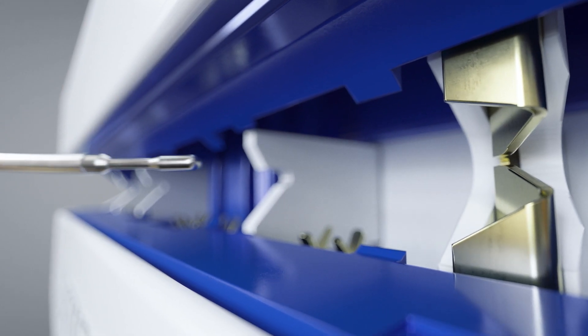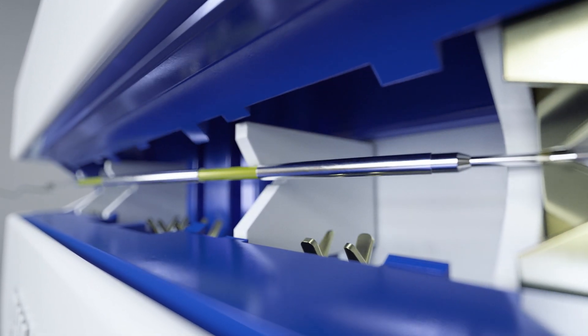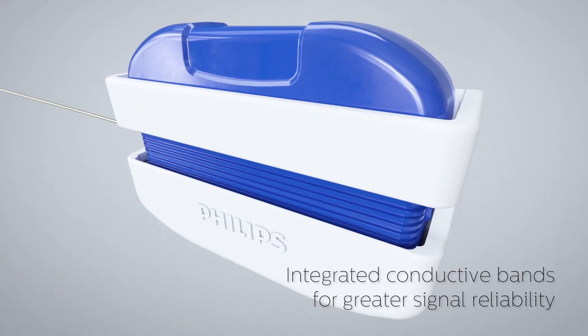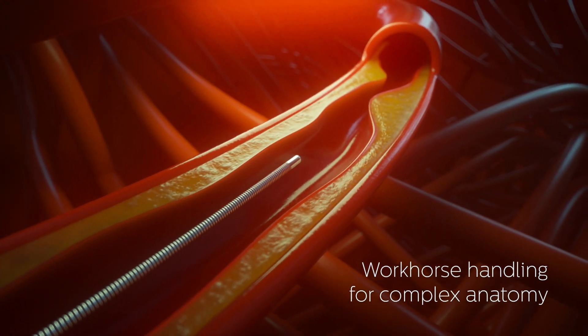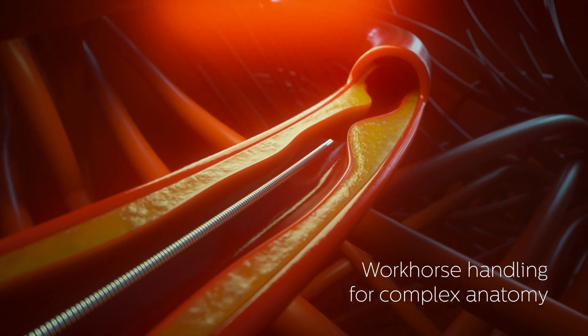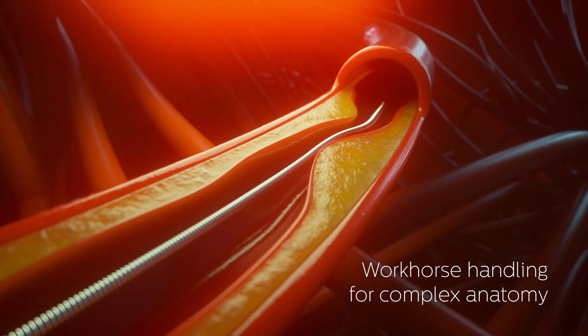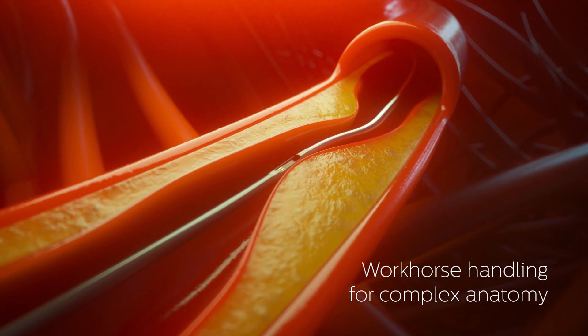The integrated, conductive band technology provides a smooth, stable connection so you can disconnect, deliver devices, and reconnect with confidence. Workhorse handling and durability facilitate navigation in complex anatomy, device delivery, and reuse in multiple vessels, making it easy to use physiology throughout the case.